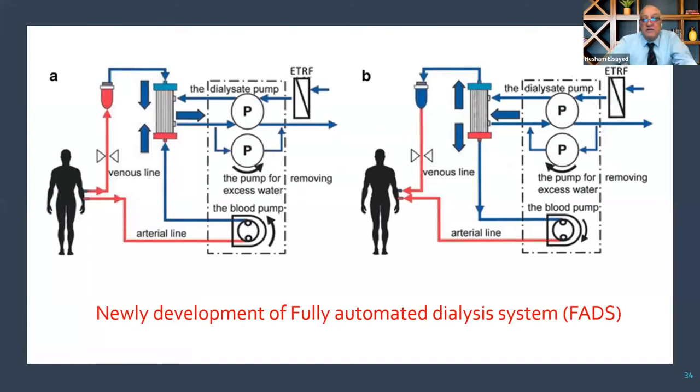This is one of the diagrams of the fully automated dialysis system. The dialysate is pushed inside the filter, so they can prime the filter or rinse back the filter by back filtration force from this side.